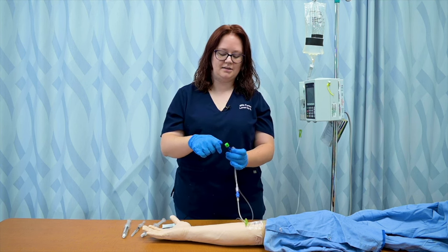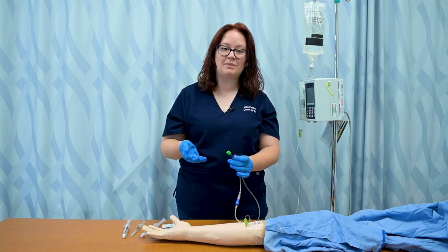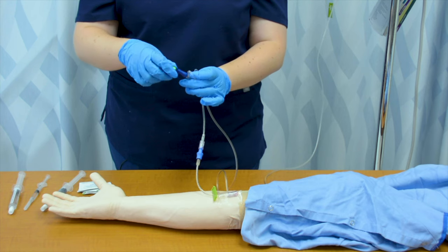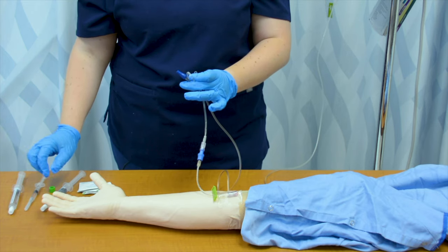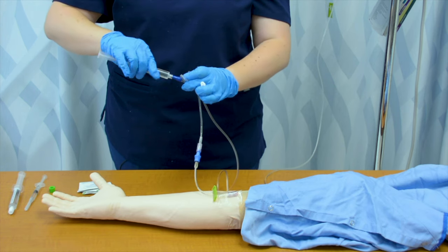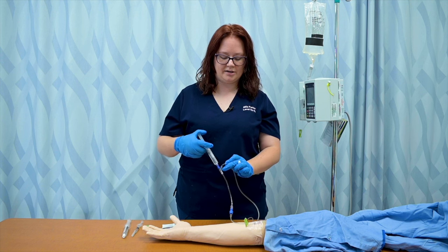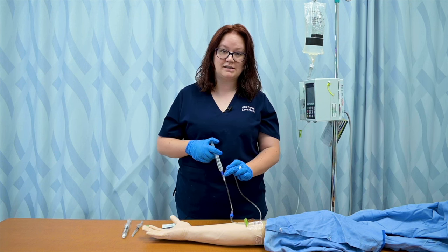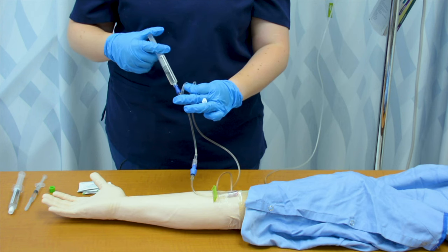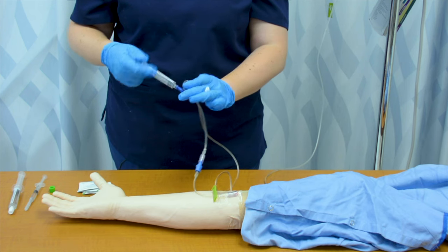I'm going to then take this protective cap off of my port. If I don't have protective caps used at my facility, I can just use an antiseptic swab to clean that port off. I'm gonna take off my cap and set it aside. I'm going to get a 10 milliliter syringe of normal saline and attach that and go ahead and flush that through so that I can clear my patient's line of whatever they're receiving through that primary tube. So I'll flush that through, clearing that line.